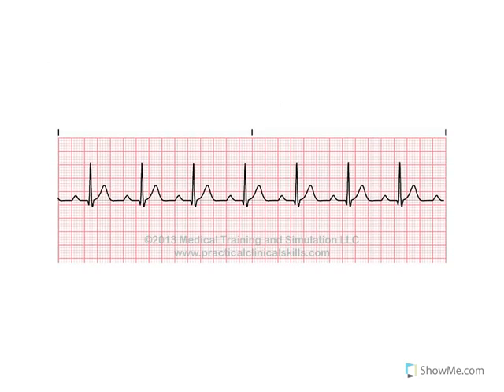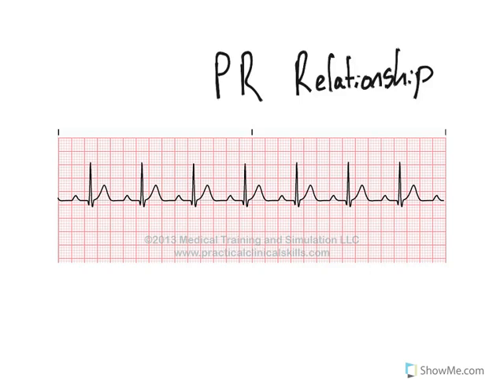So let's take a look at a few of these, and we'll see what we've got here. You can see in this one, and really when you're looking at blocks, the thing that you really want to look at is really PR. Right? So what is the relationship between the P and R? So I call it PR relationship. And it's the PR relationship, what's actually happening with the P wave, and the way that it reacts with the R, that is telling as to how that block is going.